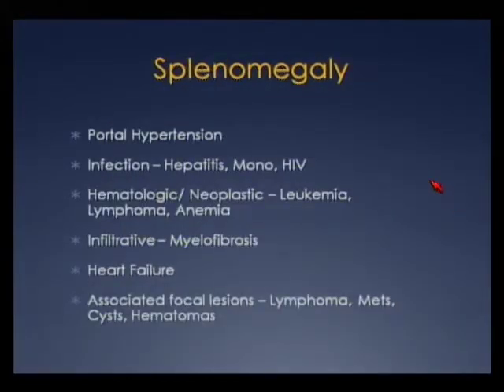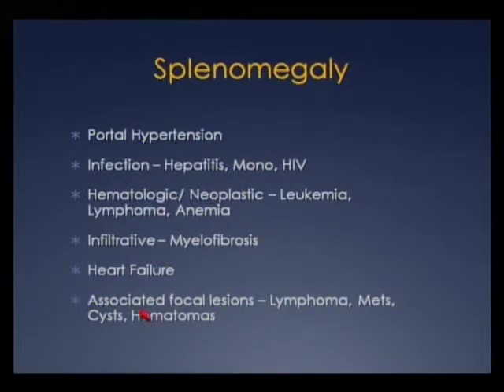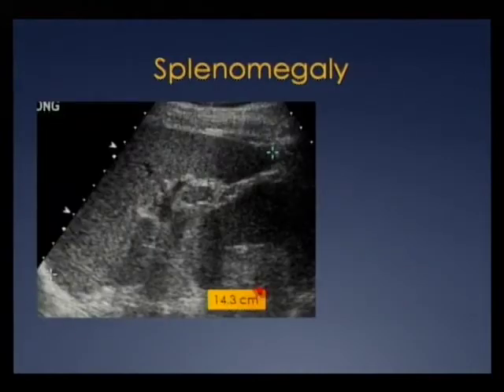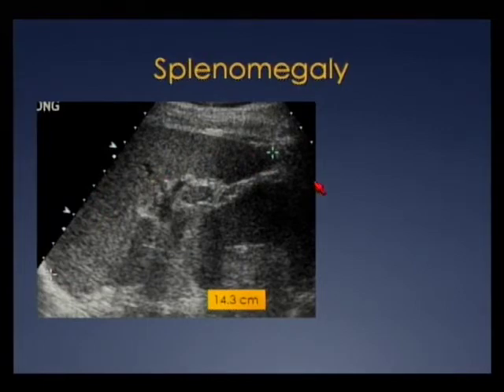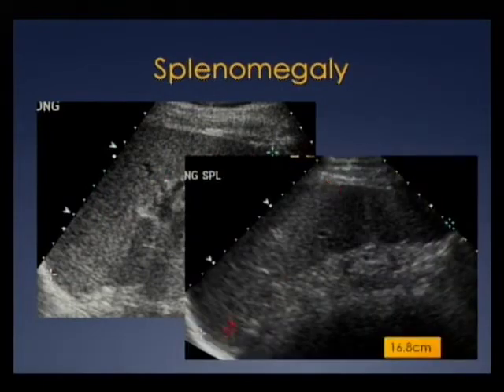Splenomegaly has many causes — most commonly portal hypertension, but also infection, hematologic malignancies, and infiltrative processes. You may also have splenomegaly with focal lesions in patients with lymphoma or metastases. Here's a patient with portal hypertension and a 14-centimeter spleen maintaining smooth homogeneous echogenicity. Another patient with portal hypertension has an enlarged spleen maintaining its crescent shape and homogeneous echogenicity.